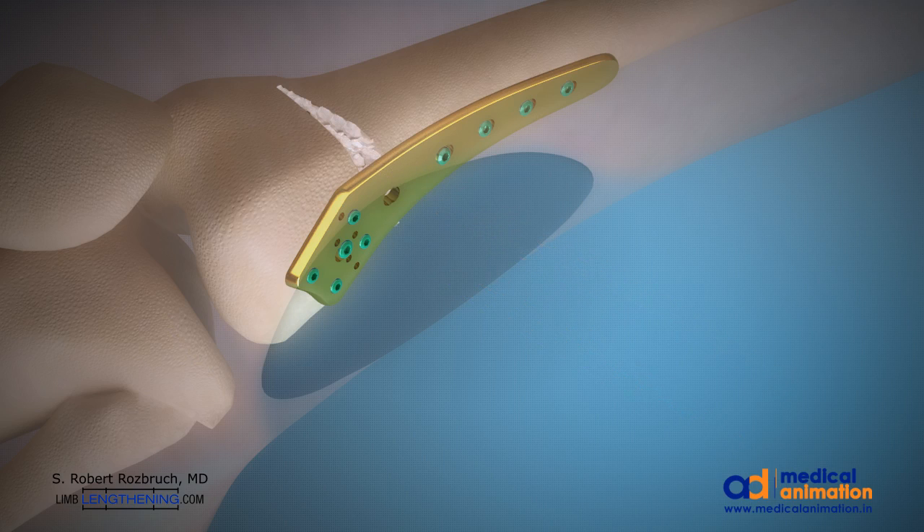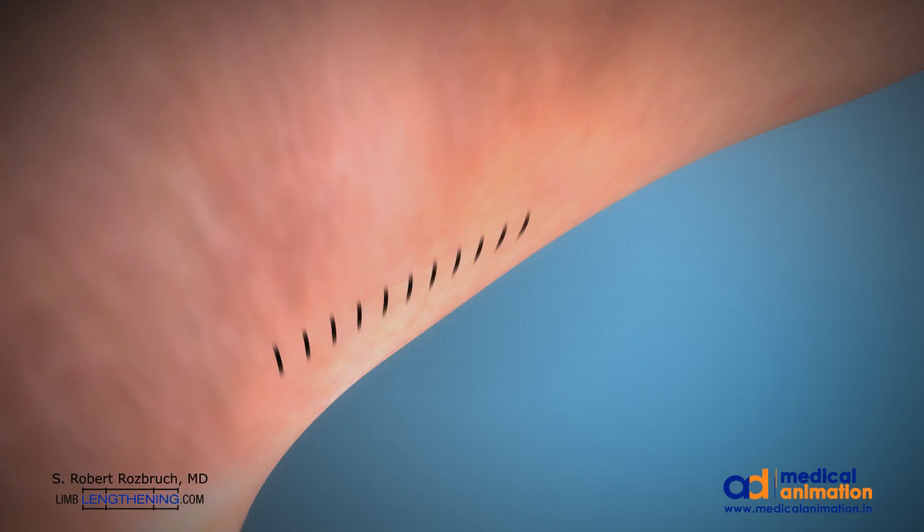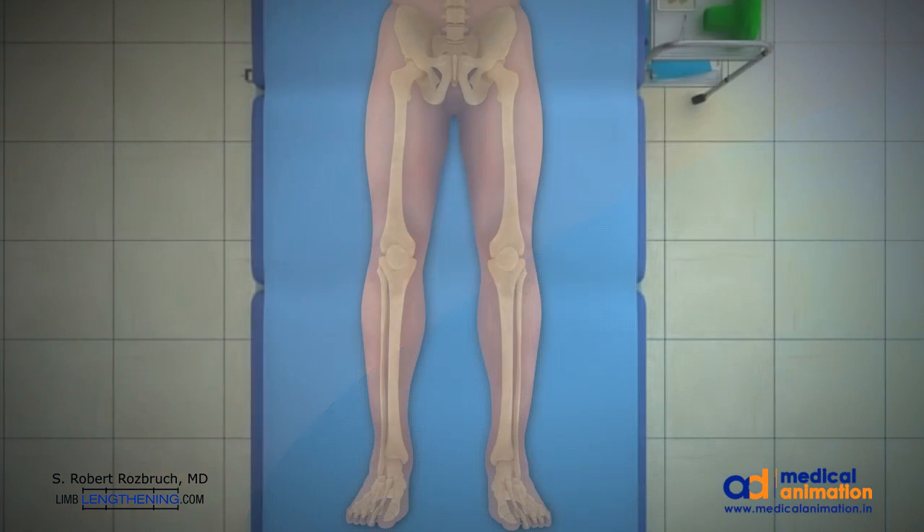A drain is placed, and the incision is closed in layers. An acute correction has been accomplished, so the patient leaves the operating room with a straight leg. The hip-to-ankle line goes through the center of the knee. Crutches for four to six weeks lead to full healing.